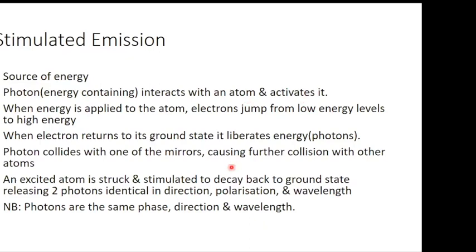So when energy is applied to these atoms, the electrons on those newly excited atoms will jump from a region of low energy to a region of high energy. And then when those electrons return to a ground state, they emit further photons. And when this happens, there are more and more collisions.